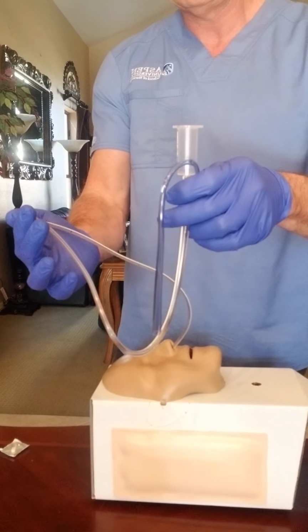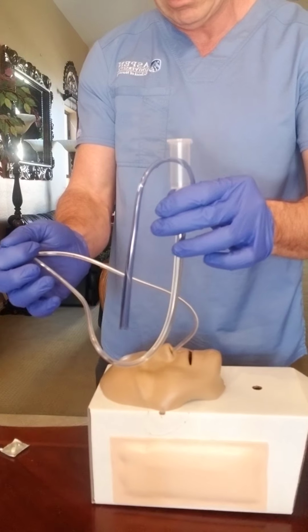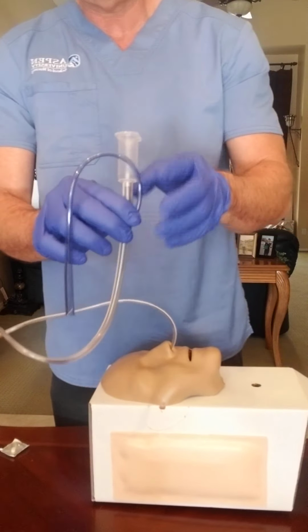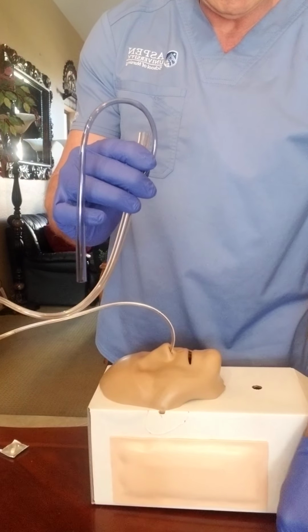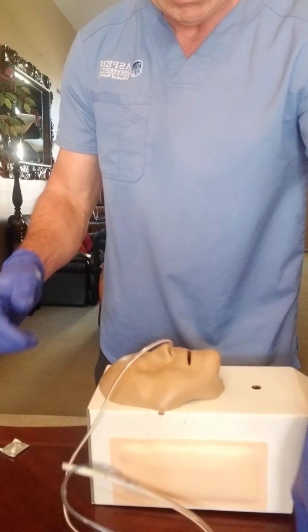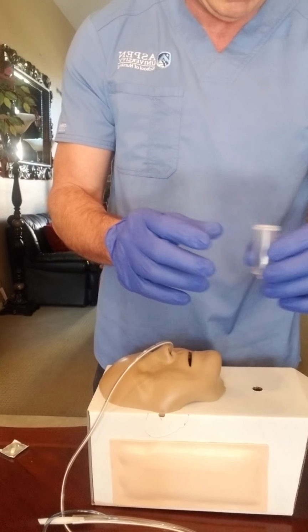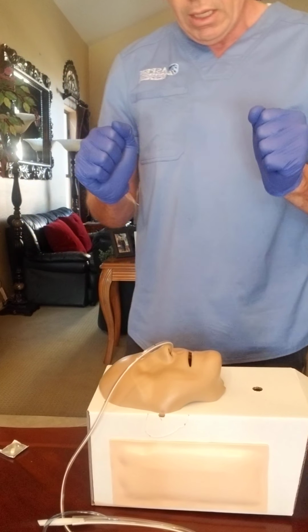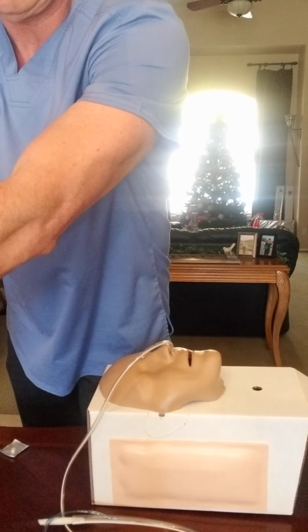Meanwhile, while we're doing this, we're asking the patient if they feel any pressure, any discomfort, or for them to tell us how they feel. Now that I am done, finished flushing, I'll remove the syringe from the NG tube. I'm going to cap it. And now that it's capped, I'm gonna rinse off the syringe because this will stay in the room with the patient. And I'm going to discard my gloves, do hand hygiene.